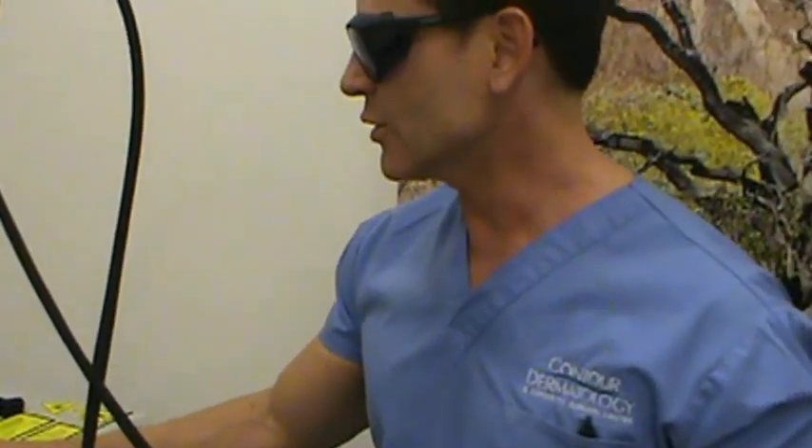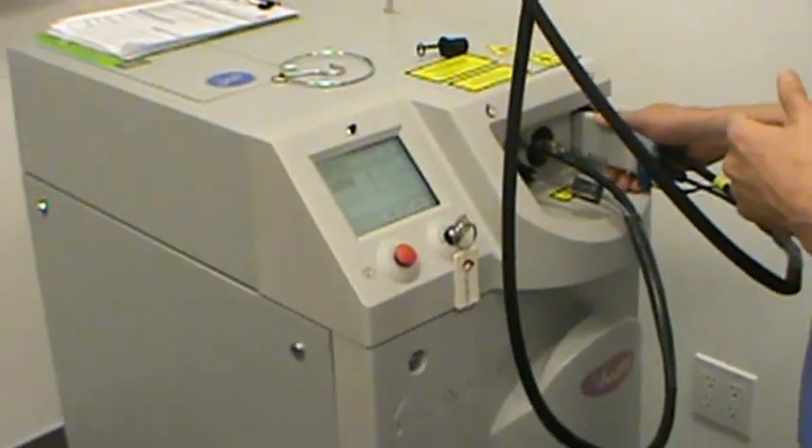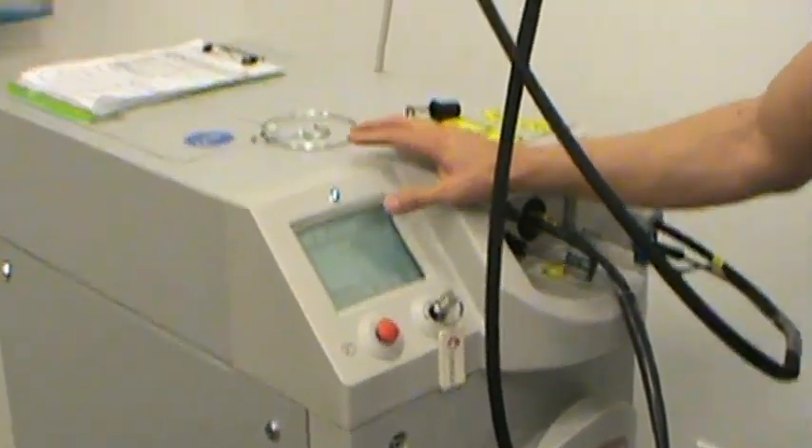Energy is just how hot you're heating the tissue. The analogy here is turning the oven to 800 versus 350. This laser also has a cryogenic spray associated with it, which is a cooling spray that will cool down the surface of the skin so the skin doesn't burn.